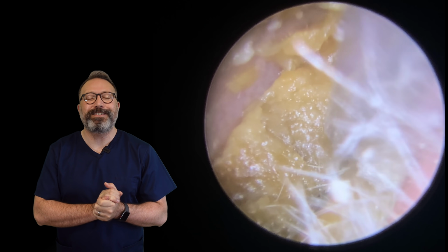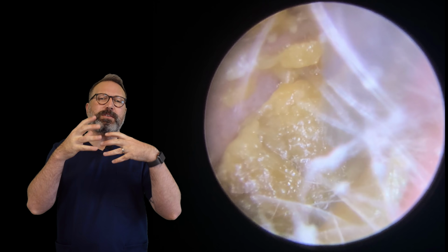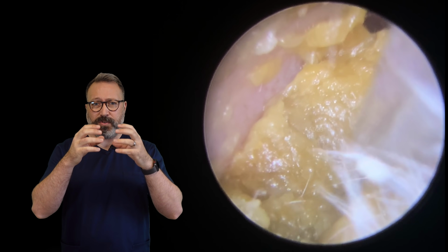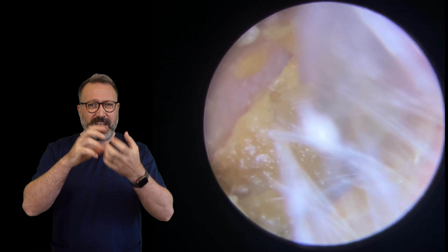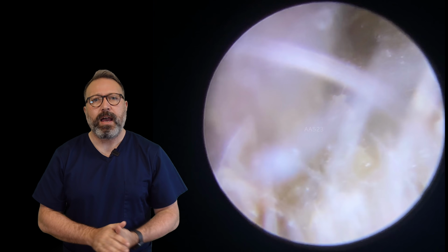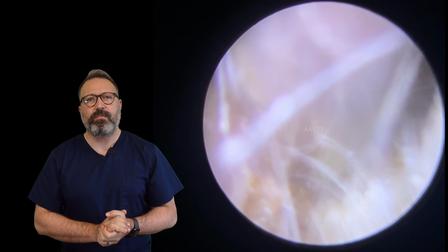So you can see this patient's come through. Oh my goodness, this was so blocked. Lovely guy, but you've got this wax and skin and it's hard and it's crumbly and it's all over the place in here. So this was a real sort of tough one to remove.